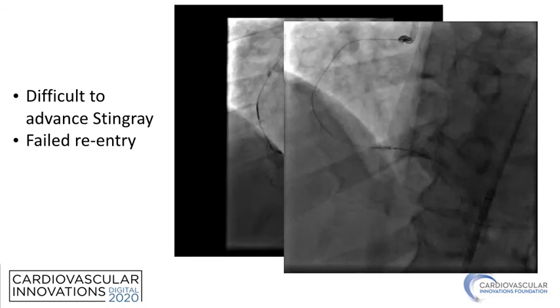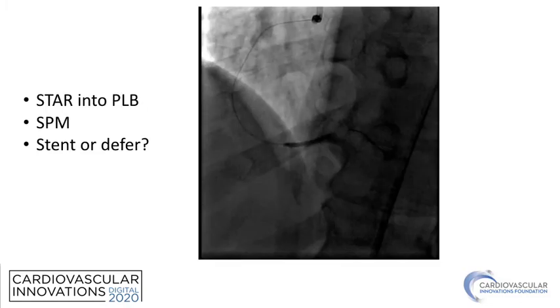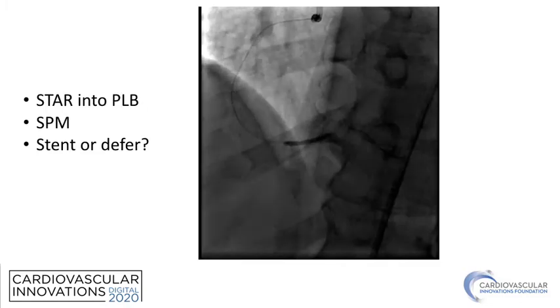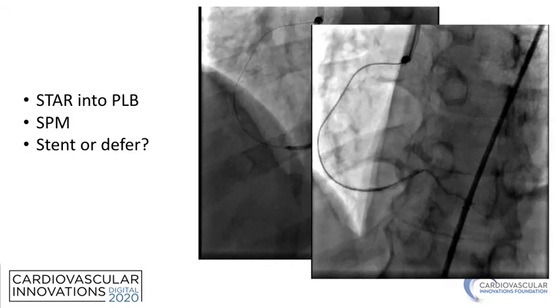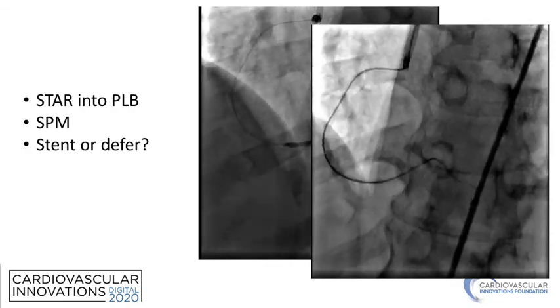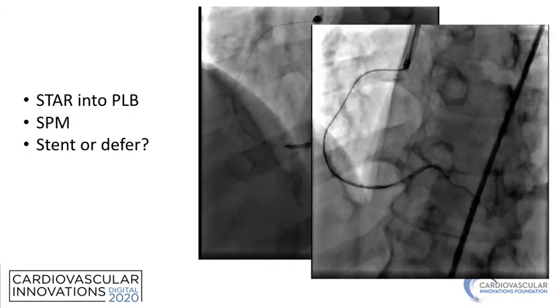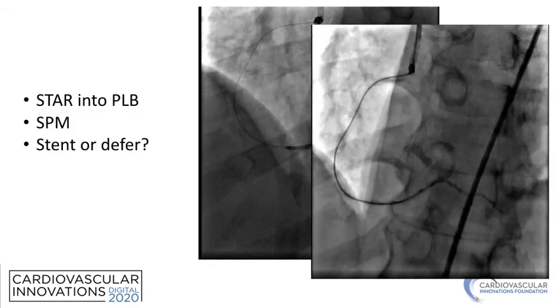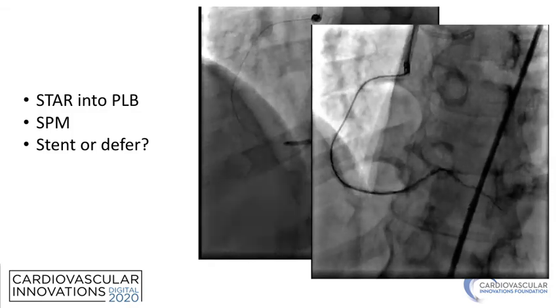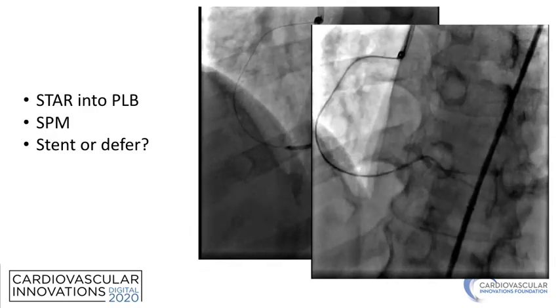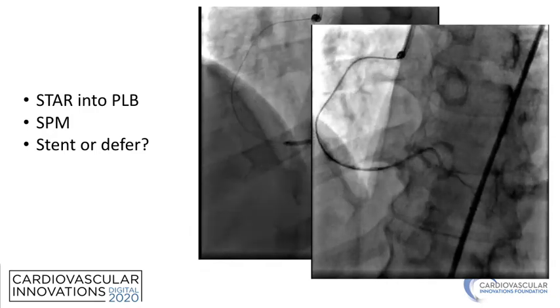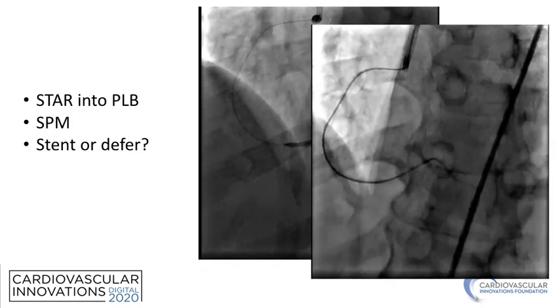We were able to get a knuckle into the posterolateral branch and dilated the whole vessel from there all the way back. However, we had relatively poor flow at the end. Note there is true lumen at the very distal end, but flow is poor with only one vessel runoff. So rather than stenting this, we elected to stop and brought the patient back two months later.